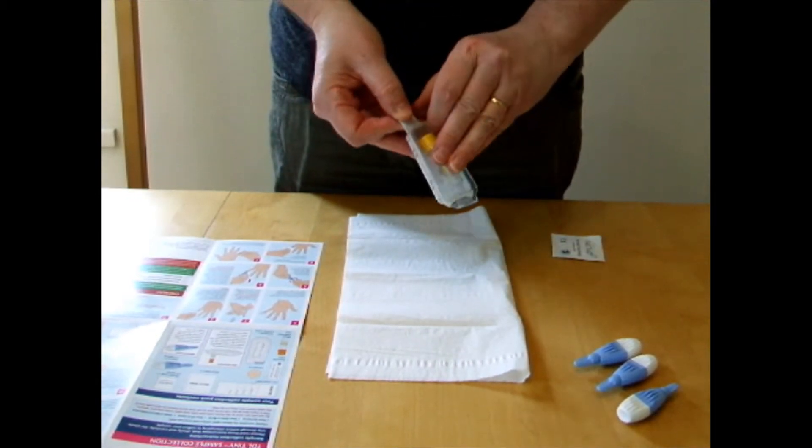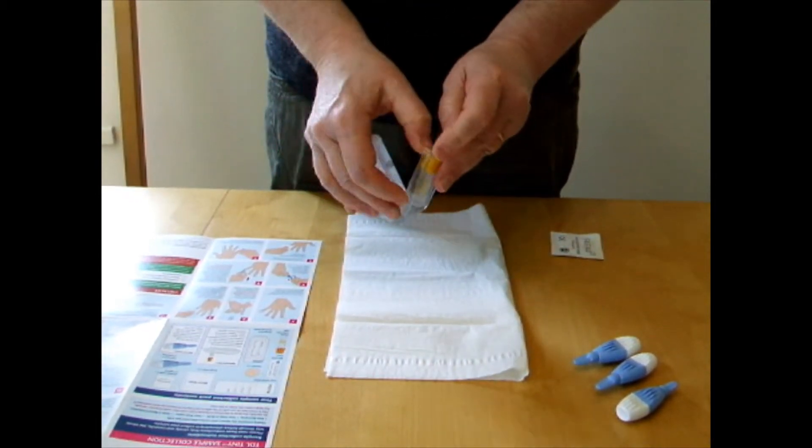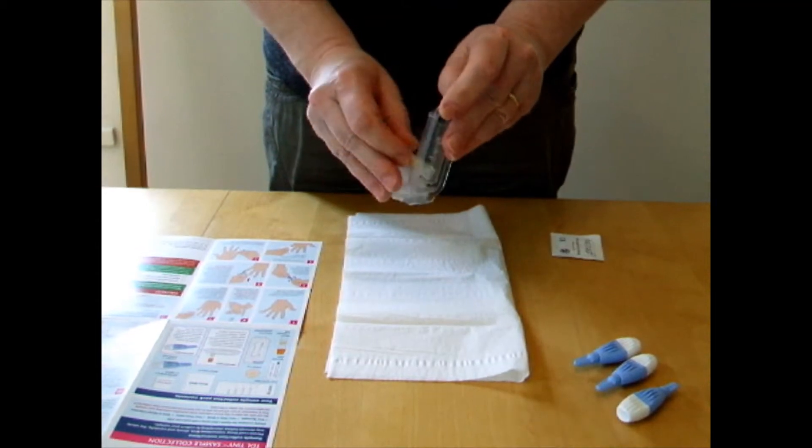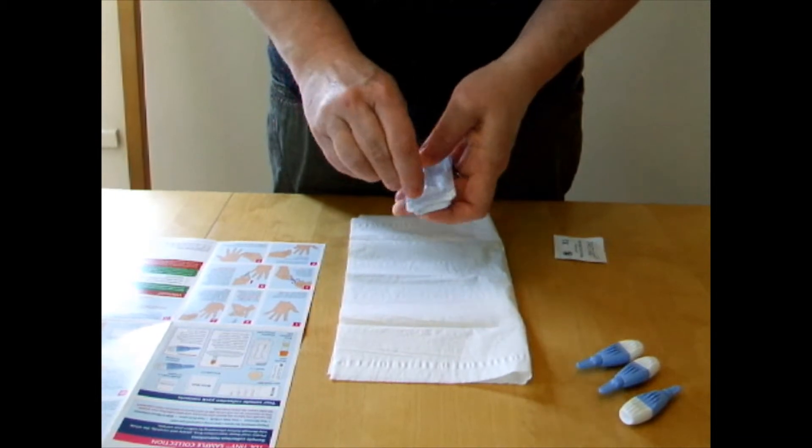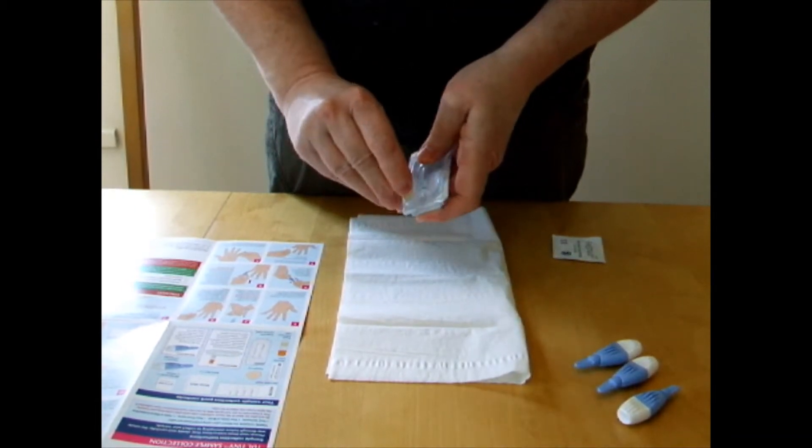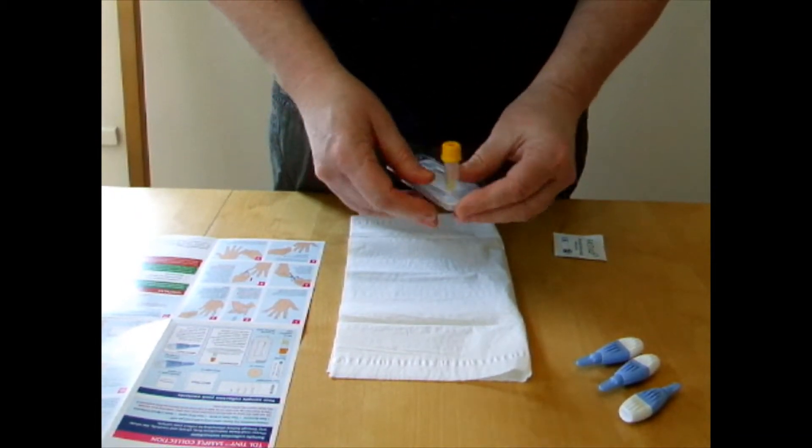When you've opened the pack, you'll find that you have a small tube and that's what you're going to be collecting your sample in. There's a little circle for you to sit it in on the end here.